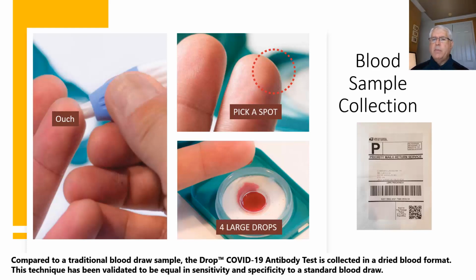And the sample medium comes in a foil pouch. Don't open that pouch until you're going to do your test. If that pouch gets opened and you said, I'm going to go do something, and 30 minutes have passed, you've spent your kit, because that sample medium really does need to be used and closed once the sample is provided in less than 30 minutes.